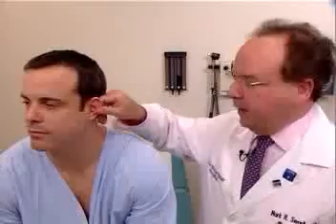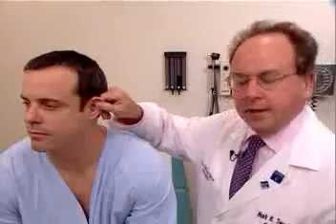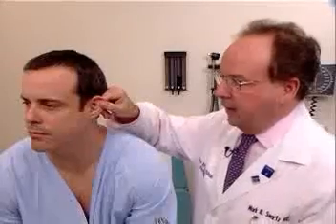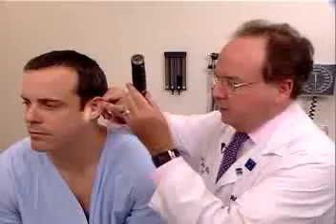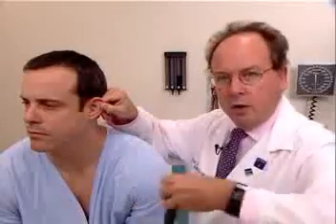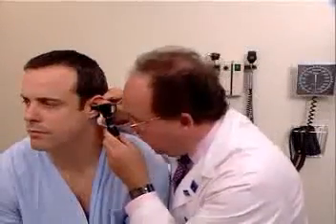To examine the left ear, the examiner uses his or her right hand to pull on the tragus and earlobe up, out, and back, and the otoscope can be entered into the external canal either as was demonstrated on the other ear, or held in this manner, and the speculum is inserted as I'm demonstrating now.